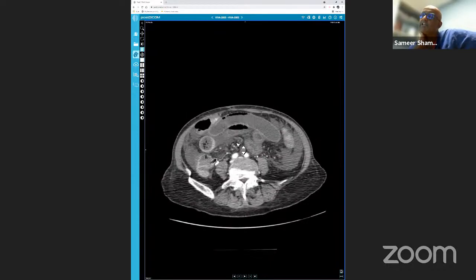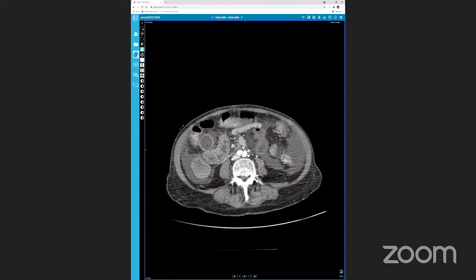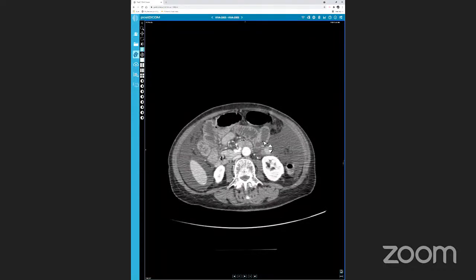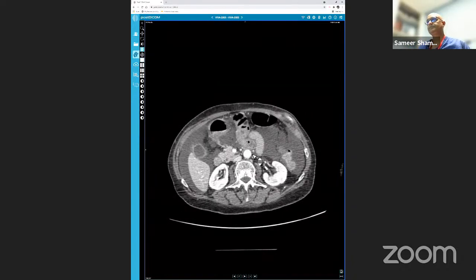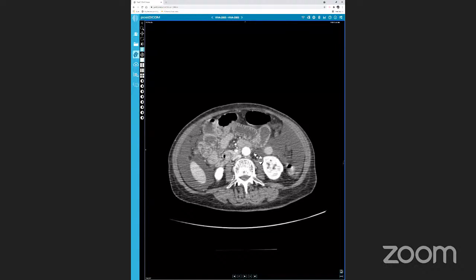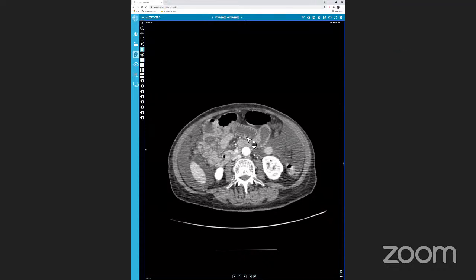Yeah. So what is differential enhancement of bowel? So the differential enhancement of bowel can be either hyper enhancement or hypo enhancement. I'm struggling with the scrolling. It's okay, you can just answer the question. Differential enhancement of the bowel. So what does that mean? Differential enhancement. You mean differential enhancement of the actual layers of the bowel, so like mucosal enhancement, and then the submucosal and muscularis.